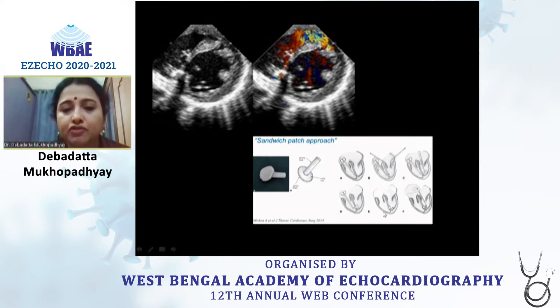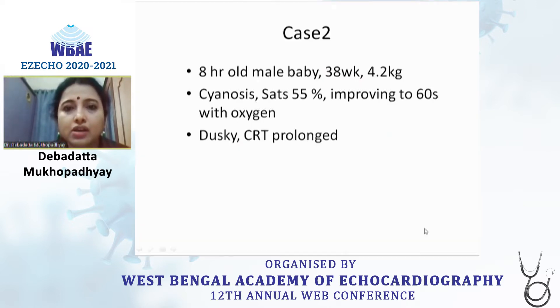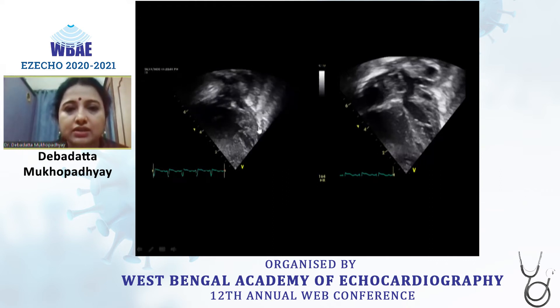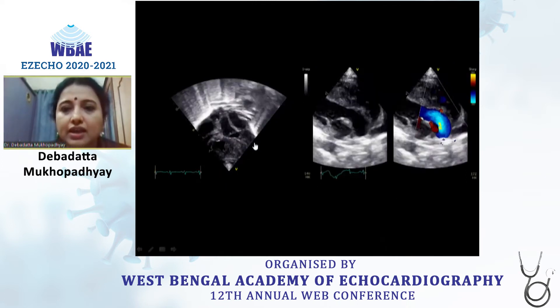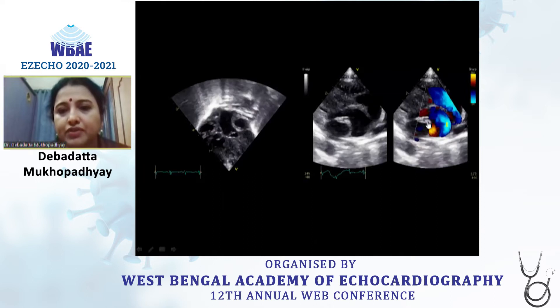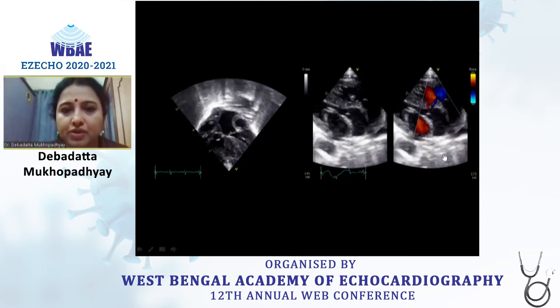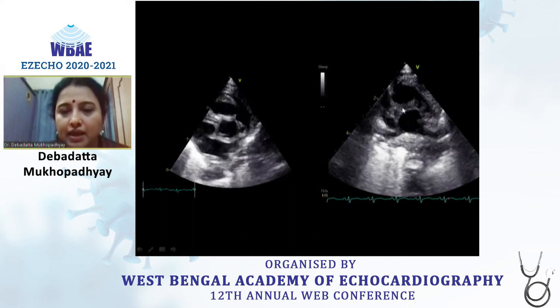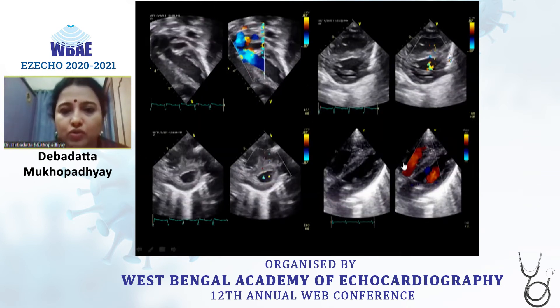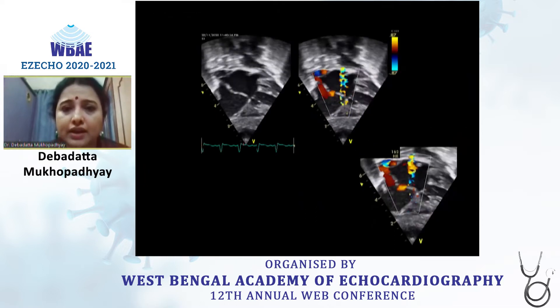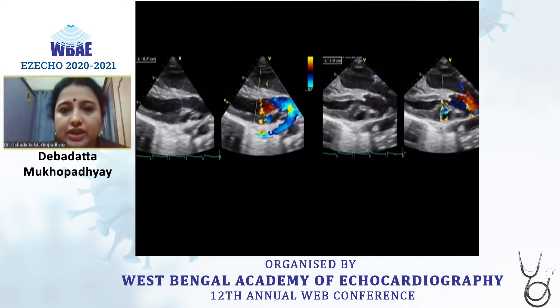Our second case is a newborn, a few hours old, who crashed in the NICU and was stabilized. This sweep from posterior to anterior showed the left ventricular outflow tract dividing into two branches, indicative of TGA. The posterior and downward sweep of the left ventricular outflow tract again showed that the pulmonary artery is arising from the LV. The great vessel alignment showed the pulmonary artery posterior dividing into two branches. There were no VSDs — this is TGA with an intact interventricular septum.